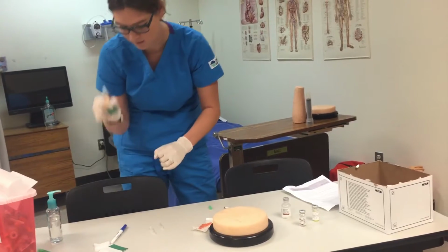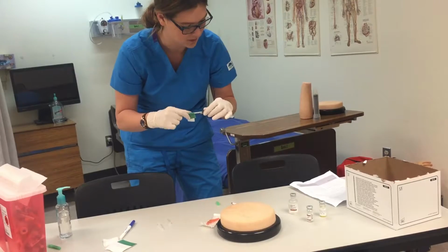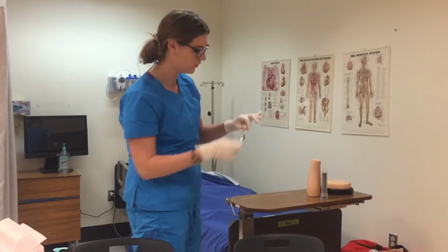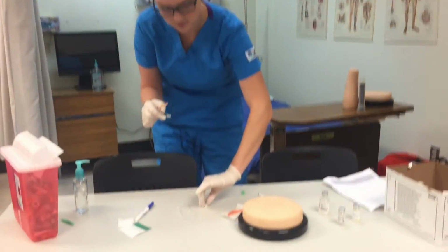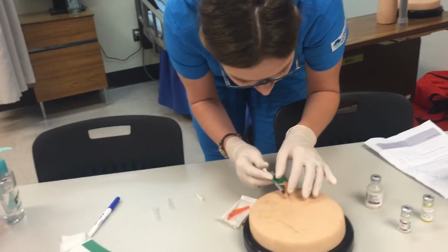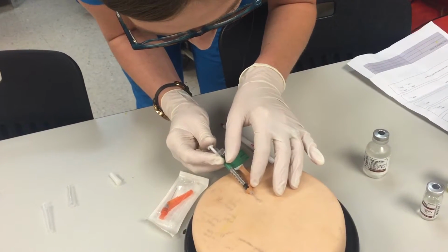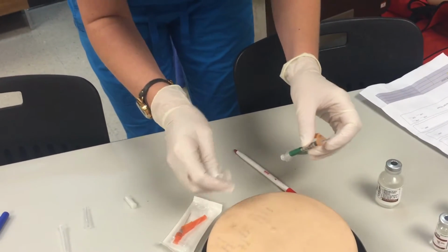Okay, now I have my TB injection, which I'm going to do an ID, which means intradermal, under the skin. So I'd turn my back from the patient. I've cleaned her skin on the forearm. I've inspected the forearm. I'd turn back to my patient using a 5 to 15 degree angle. I'd get just as close under the skin as I could get. I'd inject the solution. I have a bleb, so I did it correctly.